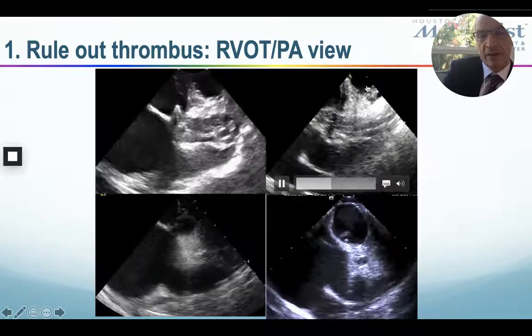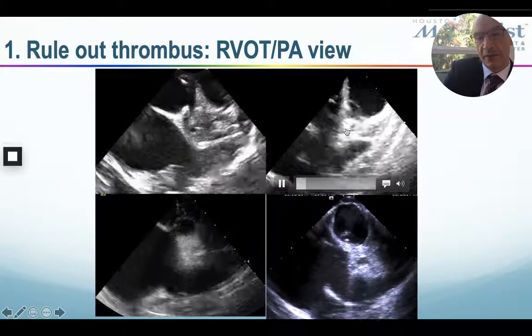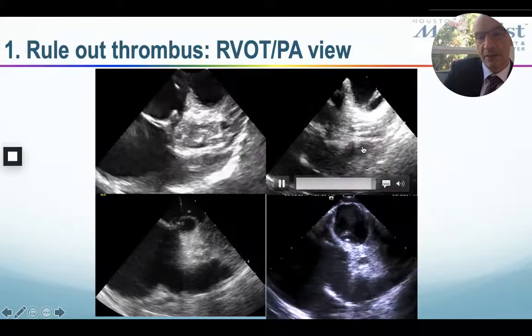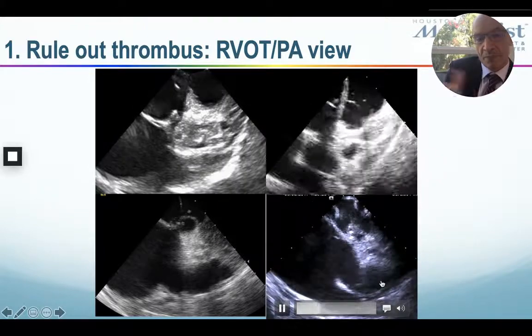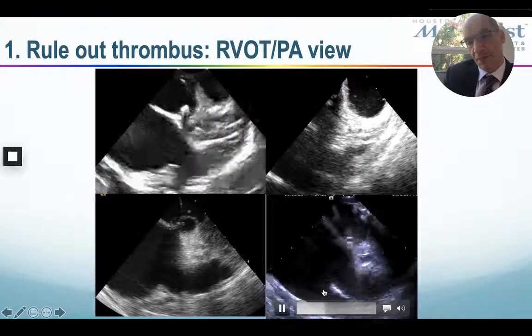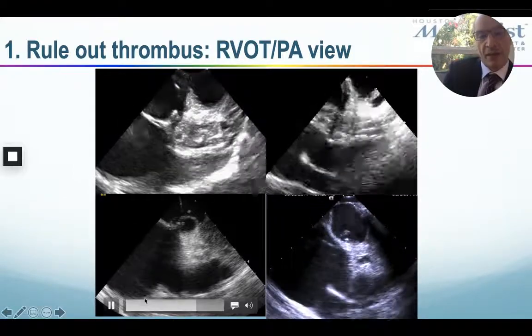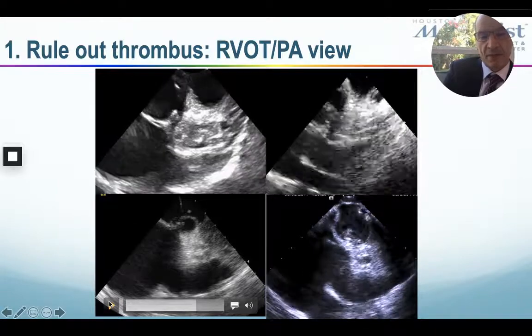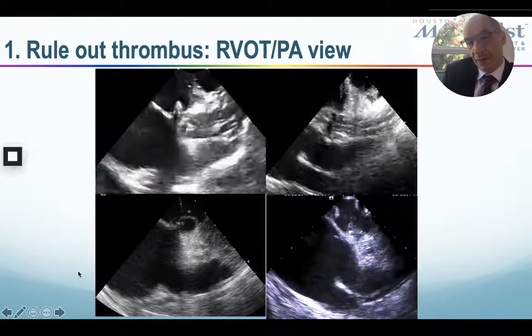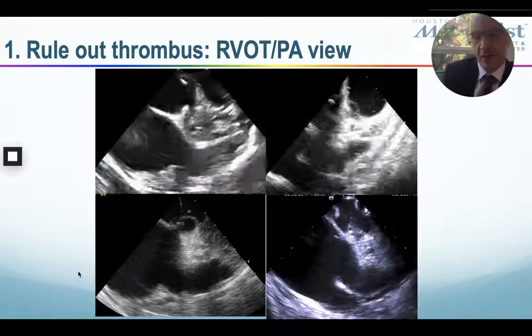Here's the same thing. You see some portions of the pulmonic valve, some portions of the left main and the LAD, and the appendage is here. You see the tip of the appendage, and if you adjust the views, you can see the ridge and get your preliminary measurements of ostial diameter and depth of the appendage. Every case is different, but the bottom line is that you can get a first screening for thrombus and a first measurement of appendage size from the RV.